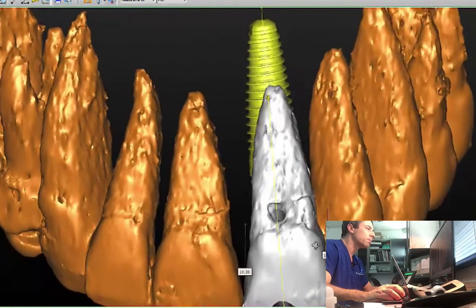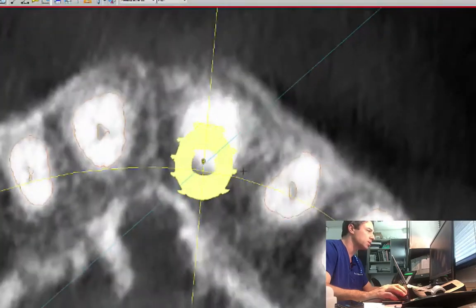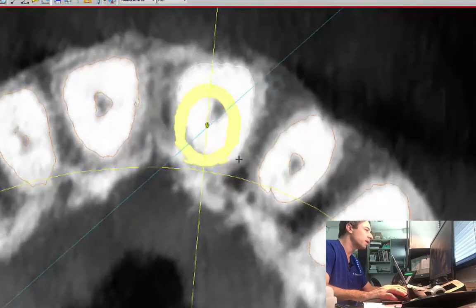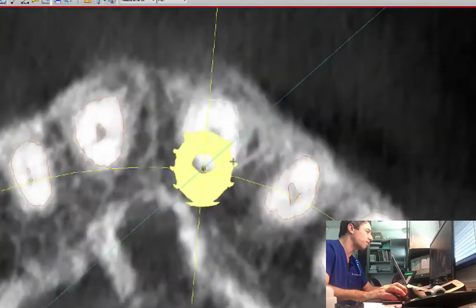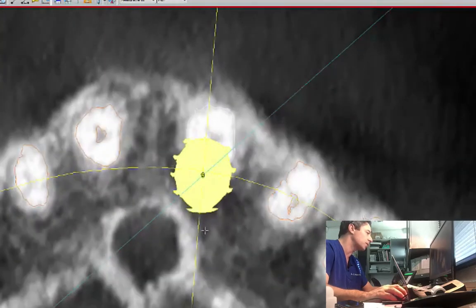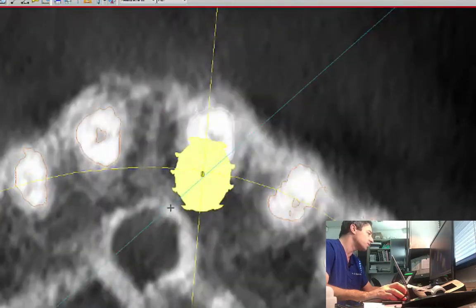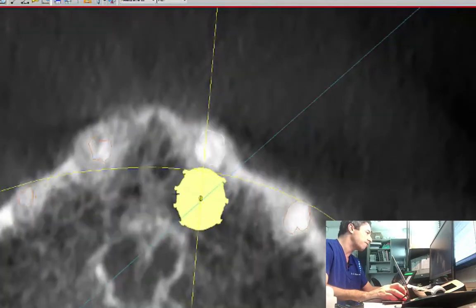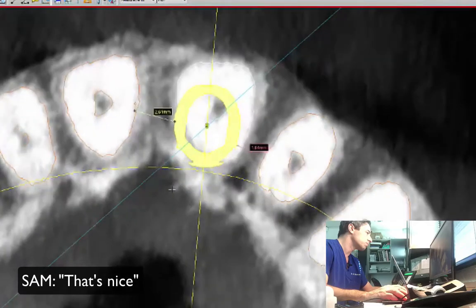In terms of space, it's going to be the closest — closer to the platform — 1.8 millimeters. And then as you go down, of course, it tapers. So it's not an issue and it's far away from — it's not touching the canal. You see the canal is safe. It's not far away, but it's not going into the canal, which is important. And we have pretty good distance to the buccal plate. Yeah, that's nice.